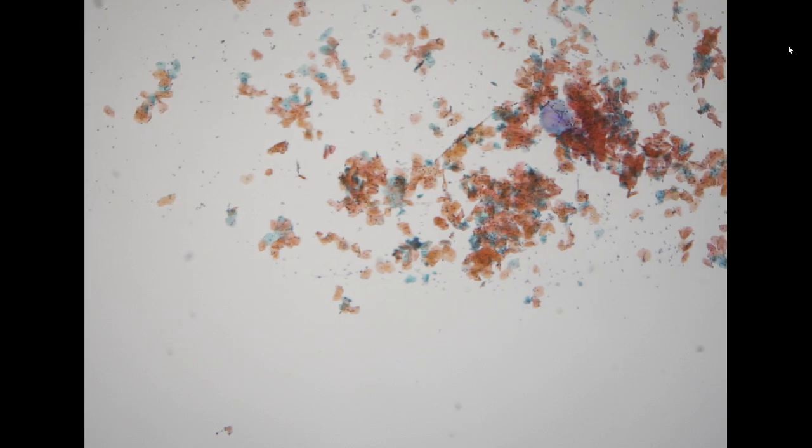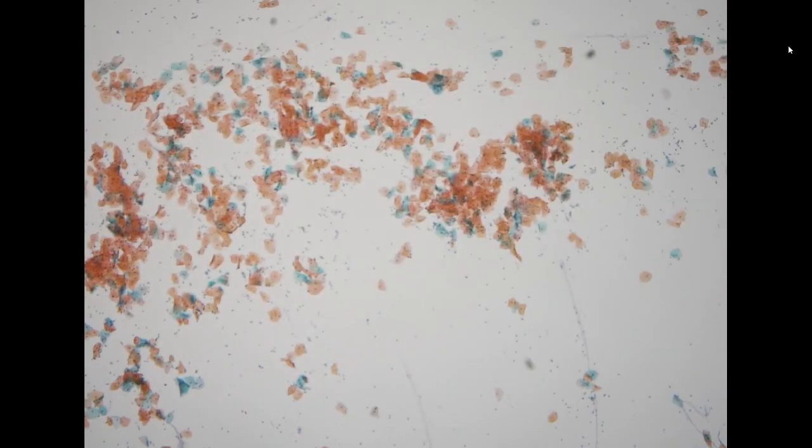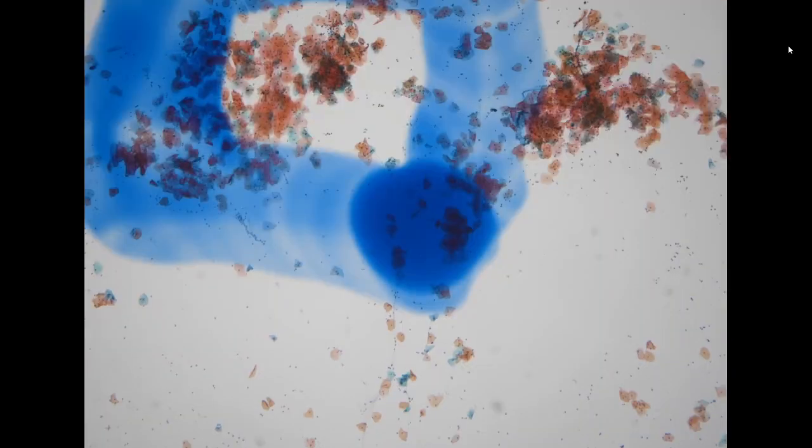So the next specimen is also in a similar situation. This is a 41-year-old female, relatively young. She had the past history of HSIL, but not in the cervix, but in the vulva. So she had the vulvar HSIL, with wide excision and with a free margin. So this is, again, a follow-up specimen for a potential precursor lesion.